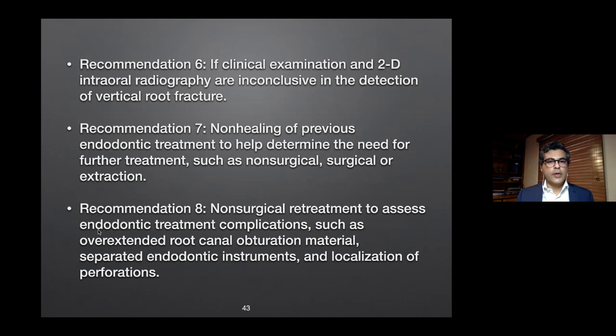kick in here. Non-healing of previous endodontic treatment, to help determine the need for further treatment, such as non-surgical, surgical, or extraction. So if you have to decide what to do, because the previous treatment is not effective, then cone beam CT can be of great help. Non-surgical retreatment, to assess endodontic treatment complications, overextended root canal, separated endodontic instruments, and localization of perforation. So this is also a very good indication for cone beam CT.